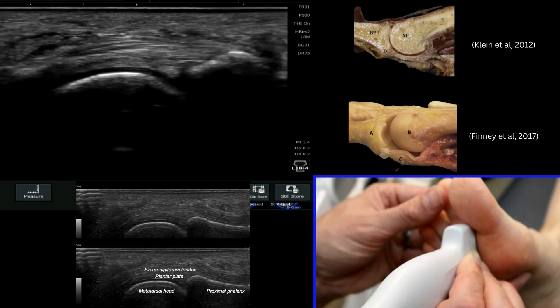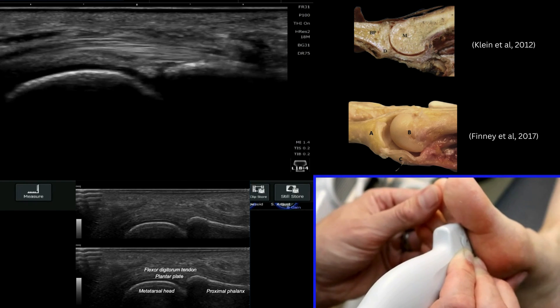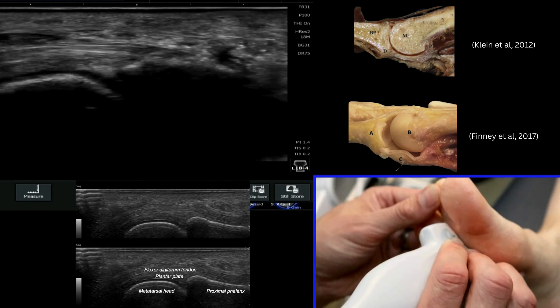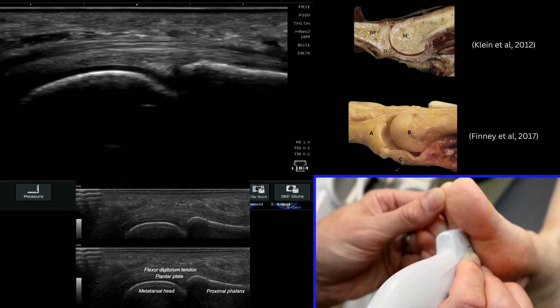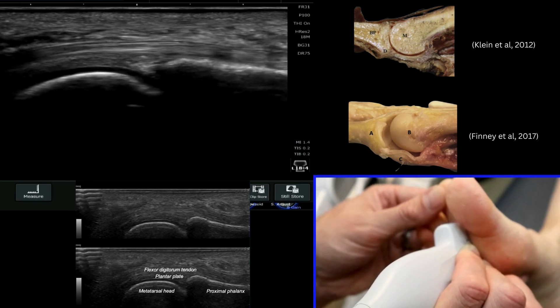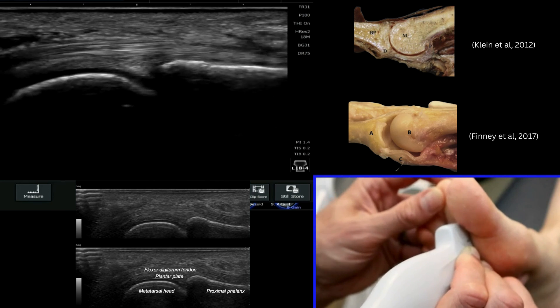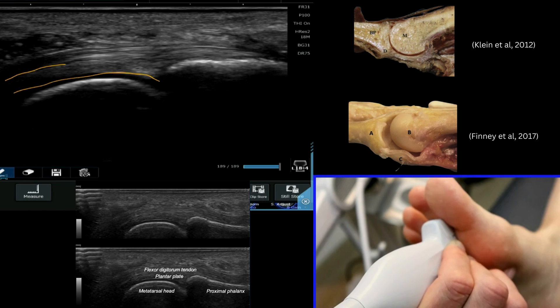Tears do tend to occur more commonly on the peripheries, so ensure that you're nice and parallel to it and not becoming oblique. You can see that I'm dropping my probe here and becoming slightly oblique to the structure. Toing slightly towards the phalanx, just drop your probe around a little bit and crisp up the articular cartilage. Differentiate with the flexor tendon by moving the distal phalanx of the toe and then you end up with a really nice view of your plantar plate. Clearly you are limited a little bit on the sole of the foot by the tissue quality and by the system that you're using.